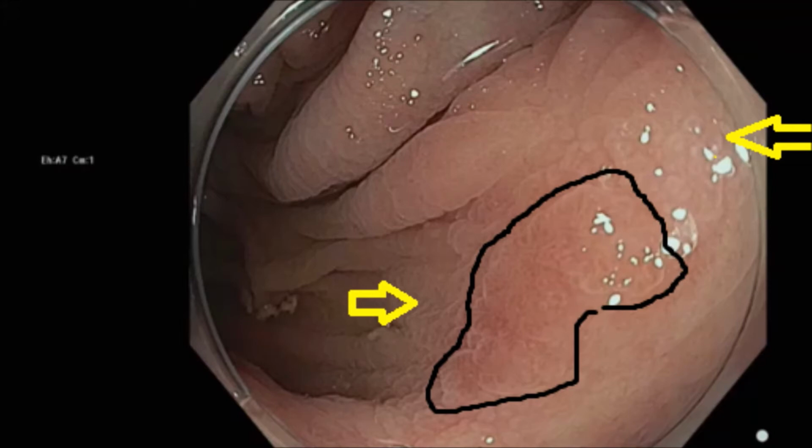Notice also the texture difference in the scar itself at this stage, less than 2 months of follow-up, compared to most of the scars that we have seen, which have been at 6 months of follow-up. So the yellow arrows are pointing to that. Looks very different at this point in time. And again, I point out that recognizing that the scar itself at different phases of healing has a texture change, a pit pattern that's different than normal, but also different than neoplastic change.